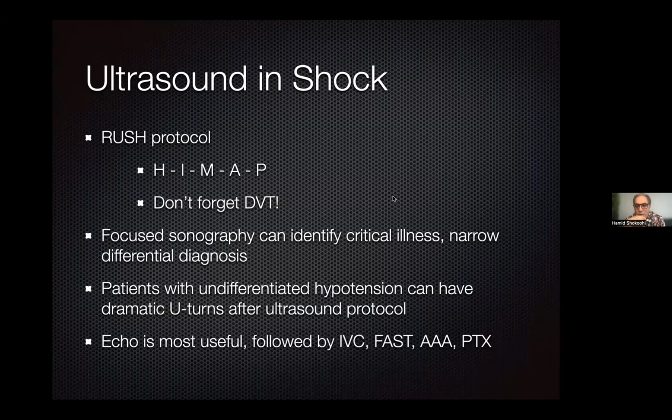So don't be disappointed if you are scanning the patient and not finding anything or changing your management. The extreme cases, the patient who has been down for a long time, the disease that has been going on for quite a while, are the ones where it helps you.